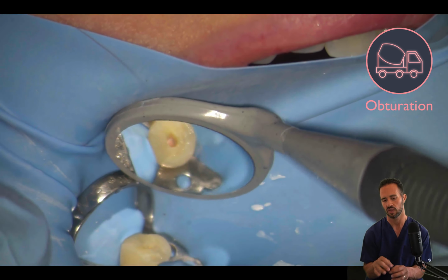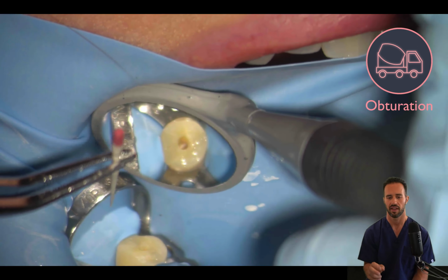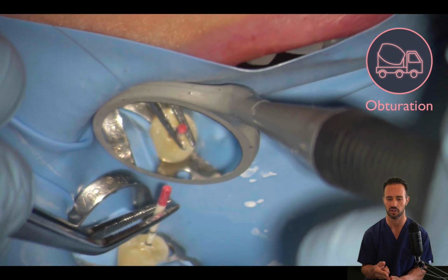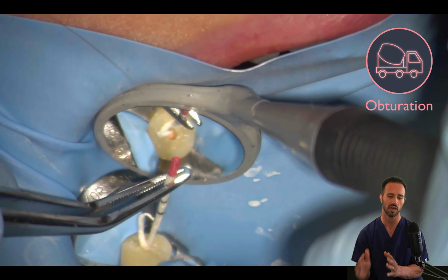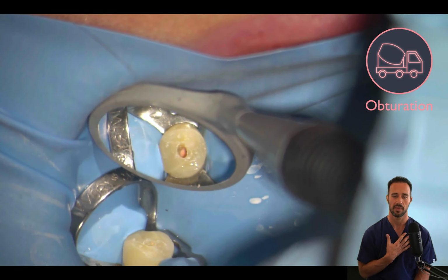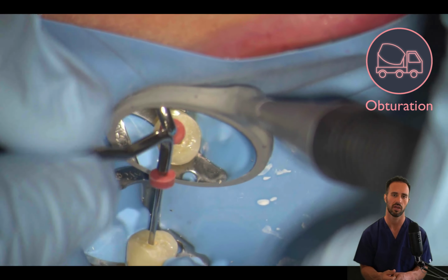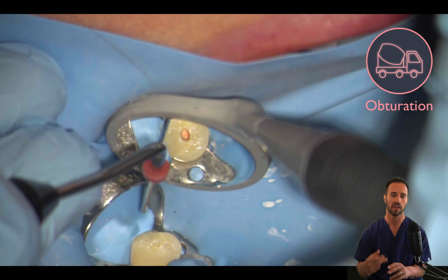And you might find that you need to kind of play with the internal aspect with the paper point and maybe with the pluggers again, just to make sure you don't have any excess sealer internally, and to make sure that there's no flakes of gutta percha or anything like that. You want to have a nice clean area that's going to set you up for the next phase, which is the restoration. And me as an endodontist, I'm going to be placing a provisional restoration or a temporary restoration, but I would encourage you, if you feel confident about the disinfection and the treatment, to go ahead and place your core buildup here.